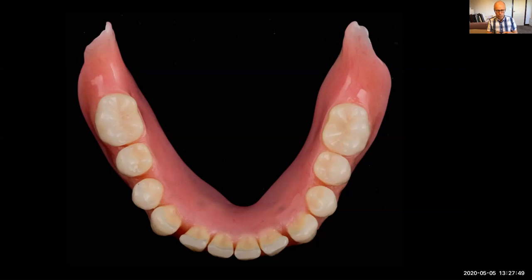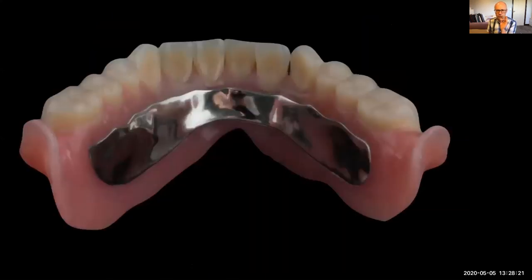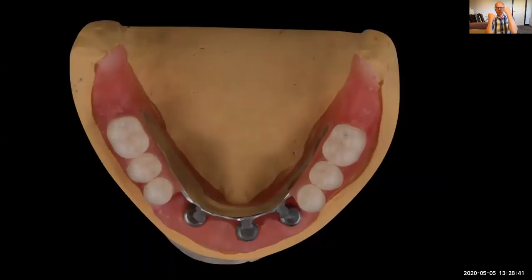So that's one approach. Another one is, this is a lady that I recently saw, Carol. She came over from Cork to see me, and she had 3 implants in the bottom there, but the denture we needed to make was thinner, and so we put a plate in. Can you see that there's a lingual plate that reinforces the denture here? And the design of that lingual plate is really, really important. It's got struts that stick out over the top of the implant attachments. These metal struts stick out over the top and stop the implants wanting to push through these housings, and it helps to strengthen that denture too.